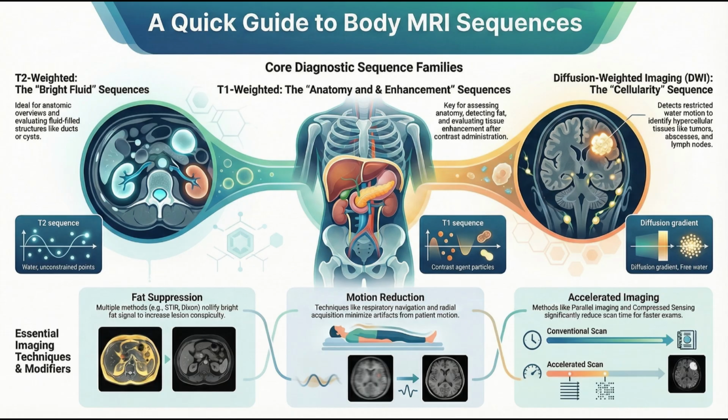The third is your T1-weighted dynamic contrast enhanced sequences, DCE. This is for after you inject gadolinium. Precisely. This is the key for detection and characterization. We watch how tissue enhances over time. Wash in, wash out, arterial phase, venous phase. That dynamic information is what fundamentally dictates whether we call something benign or malignant. If you have those 3, you're set.